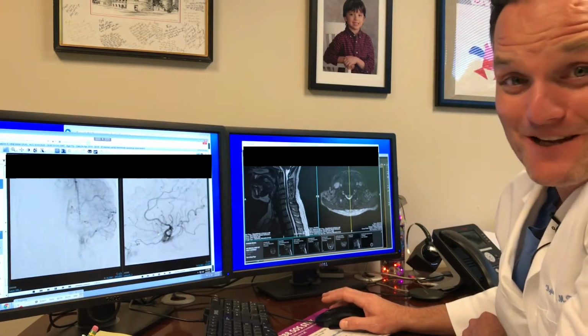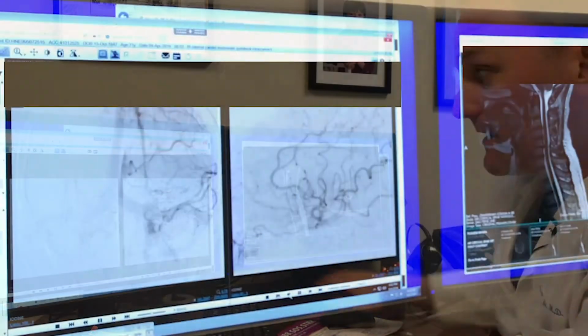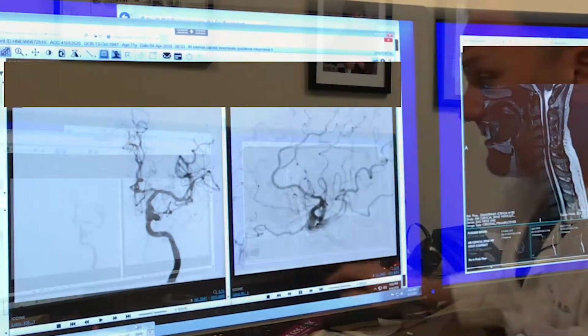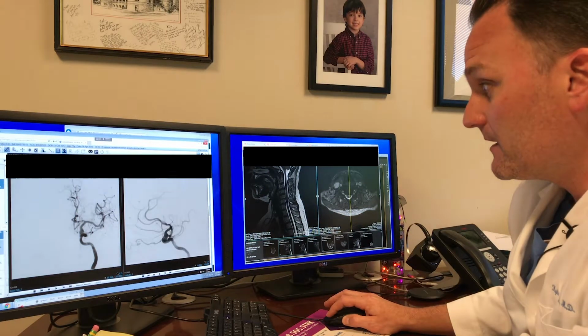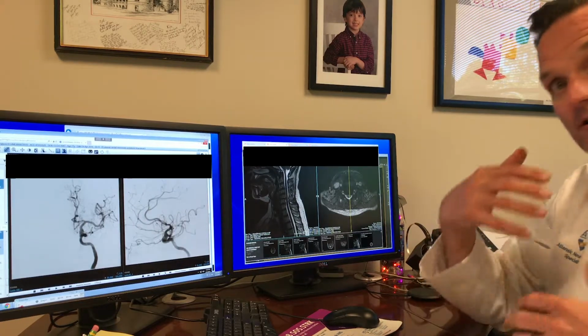And that's cerebral angiograms. And this is what we do. Basically what happens, like on this angio, let's pause it right here. A blood clot will form somewhere else in the body, maybe the heart, maybe somewhere else. There can be a bunch of different reasons, but it flows up and can get into the brain. And patients will have an acute stroke where something will stop working. They'll have weakness on one side or slurred speech or inability.